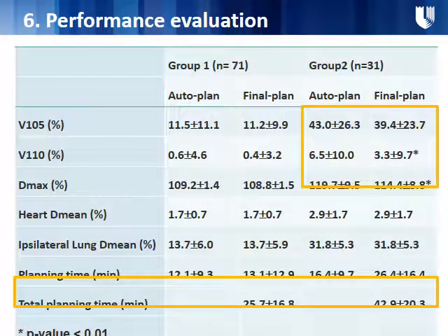Then how about dose homogeneity? Auto plan and final plan were not much different for group 1.